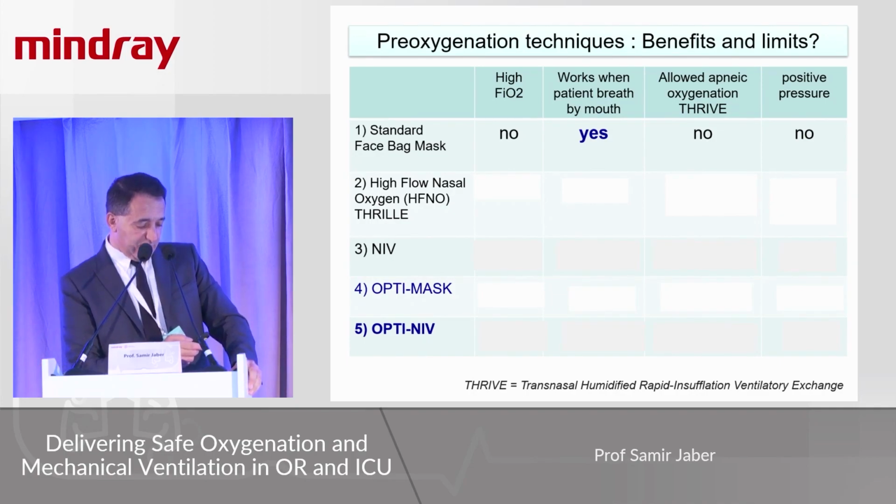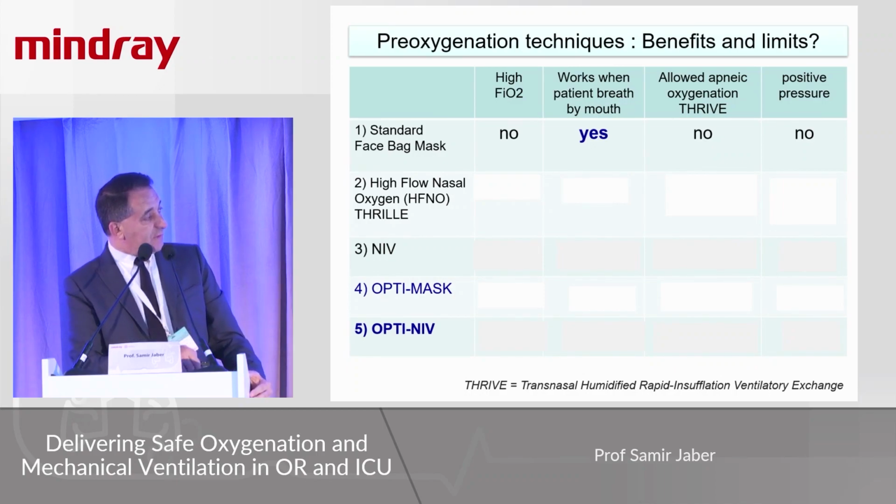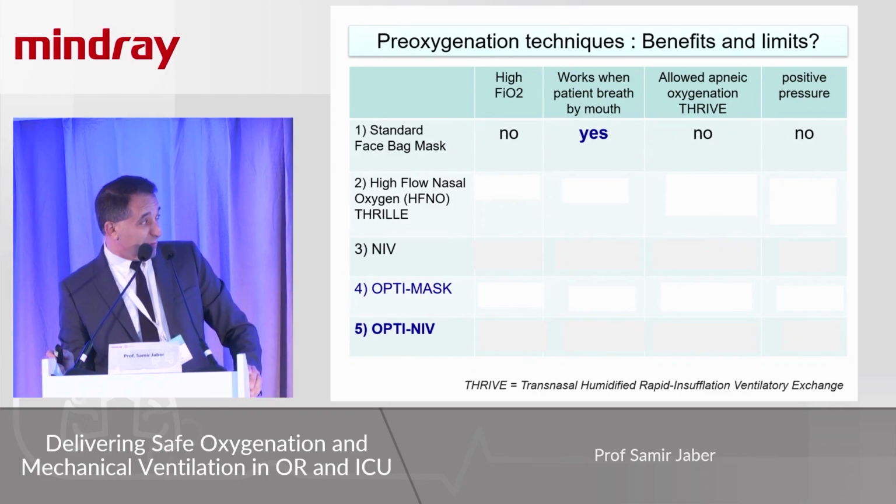As you see in this table, I put in the left column the 5 techniques, and you see here in the table the major way to work. To deliver higher FiO2, it's not possible with the standard face mask. It works when the patient breathes with the mouth open.